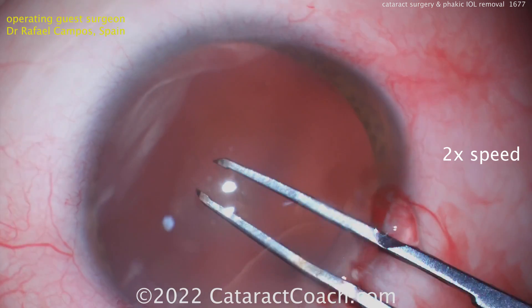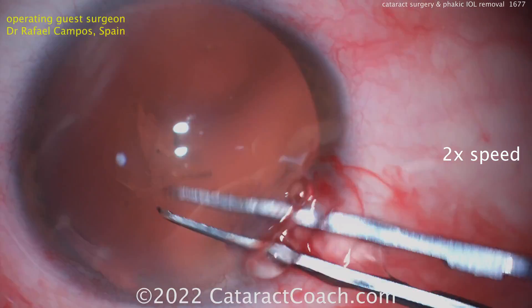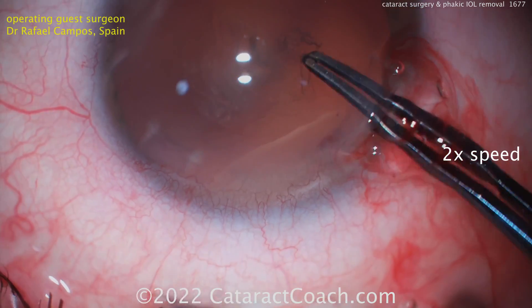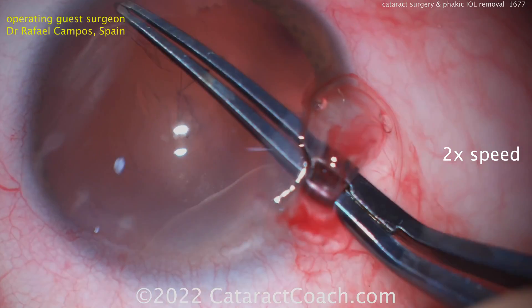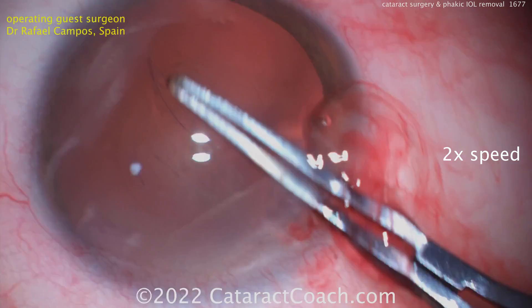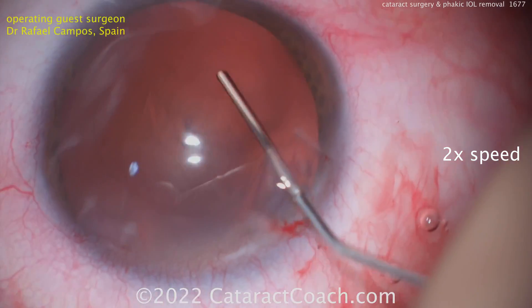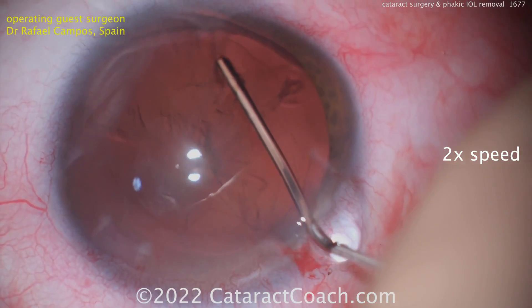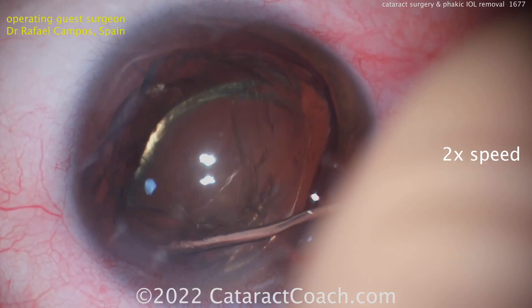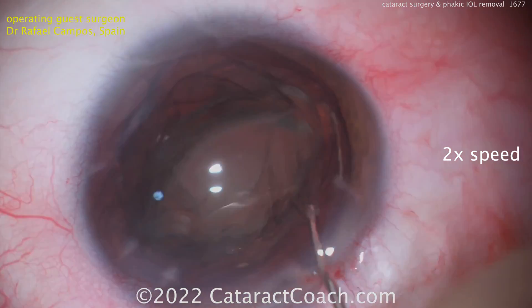Let's talk about lens calculations. How would you do the IOL calculations in someone with a phakic IOL? Remember, you're measuring with optical coherence biometry — measuring the axial length and AC depth with an optical method. Your common machines like the IOL Master, Lensstar, and similar devices measure right through the phakic IOL, so you'll have an accurate axial length and accurate corneal measurements. You actually don't need to account for the phakic IOL in the lens calculations.